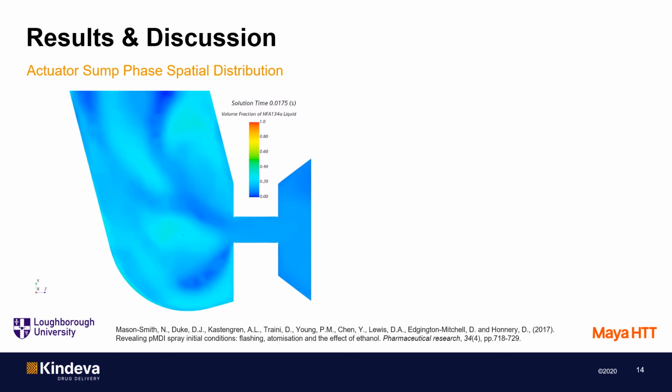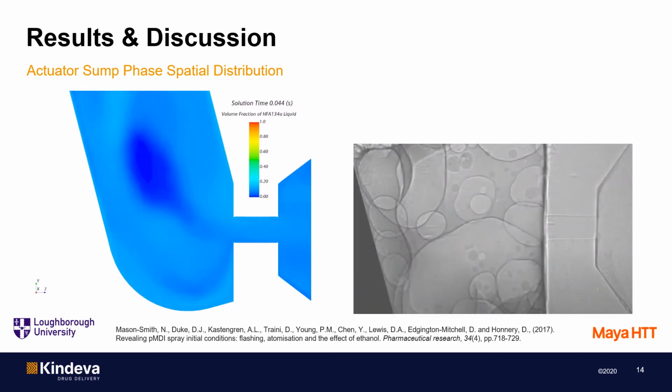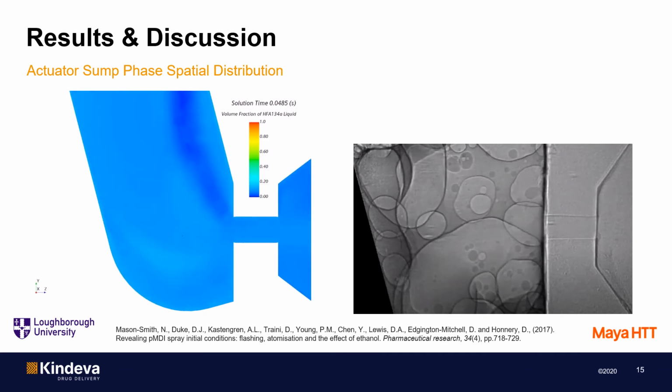As we move towards the end of the actuation event, the two-phase mixture in the sump becomes more vapor-rich and forms a homogeneous mixture. Experimental observations also suggest that the flow is predominantly vapor, with some liquid forming small interfaces. These small interfaces are not captured by the current CFD model due to the deficiencies of the VOF approach and the resolution of the spatial discretization. These should be addressed in the next iteration of such modeling activities.